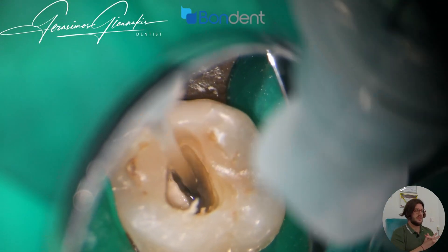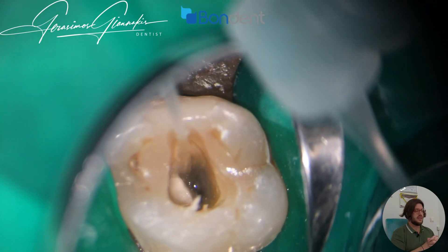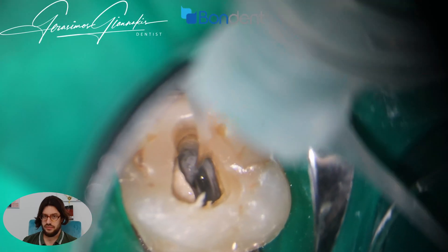Of course, we need irrigation to remove all the debris and not obliterate the canal. Here I'm using EDTA liquid, which is very helpful.